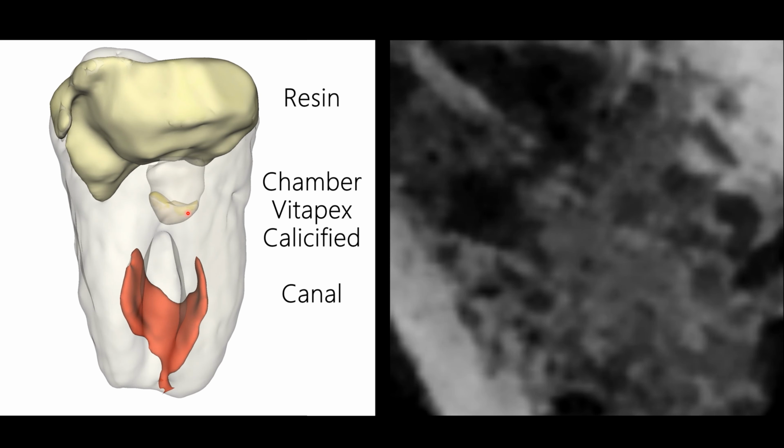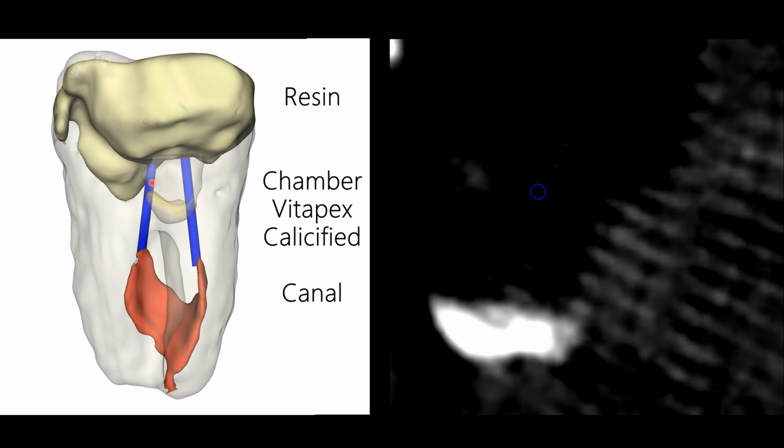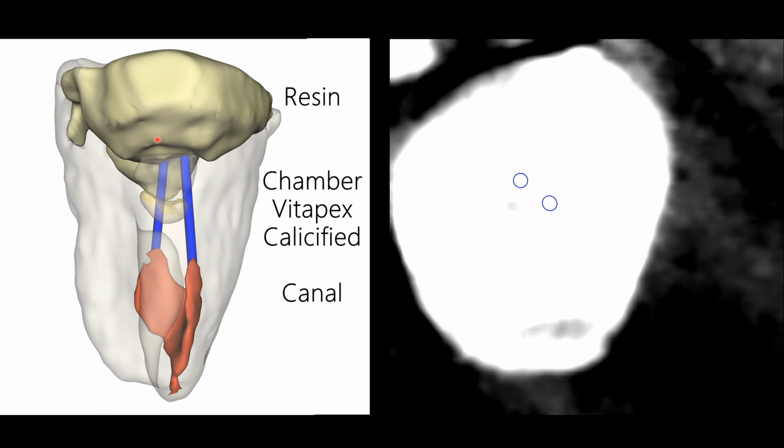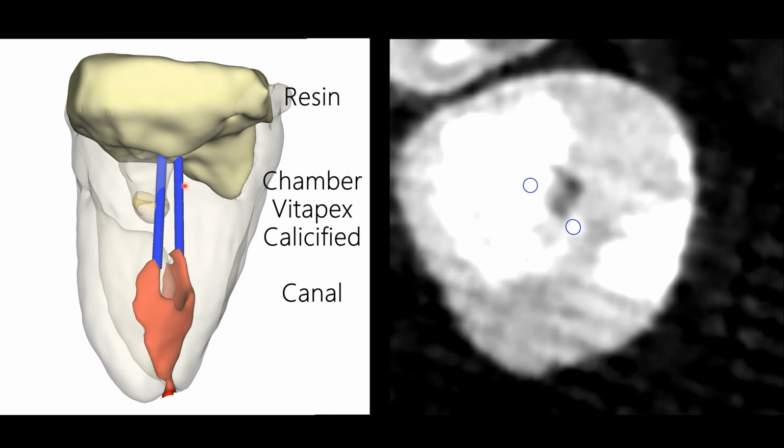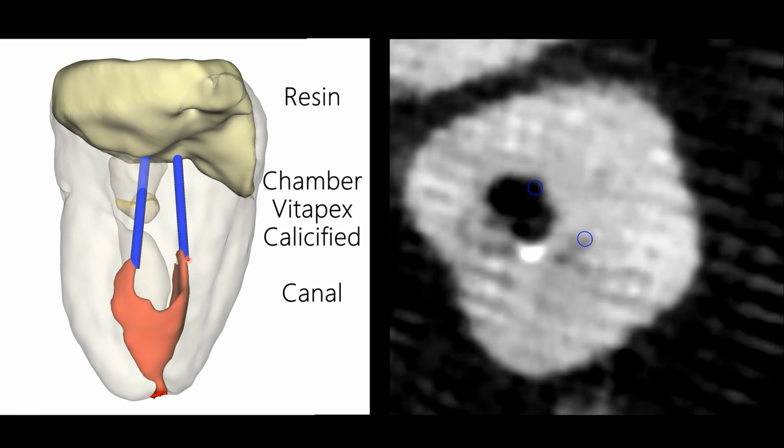So after this, we took the CBCT. As we can see, my direction is right. I went with the right axis of this tooth, but it's C-shaped. I cannot find it here. Here is the perforation, so I need to go in these two directions to find the C-shape. So I used the navigation system with these two drill paths to reach the C-shaped root canal.